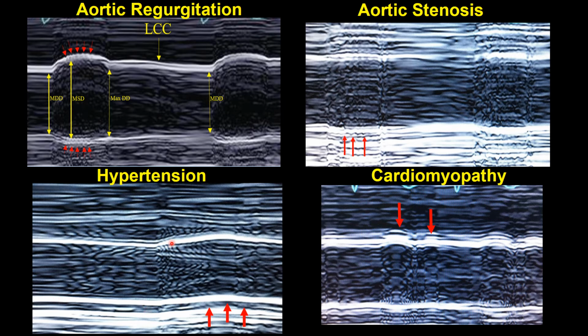But there is movement of the artery. The artery is jumping forward and then falling backwards. And we can see the horizontal lines show horizontal flow. But now we're seeing flow in two directions. It's both horizontal and inferior. And now the blood flow is both horizontal and superior. There's a brief period here where we see horizontal blood flow again.